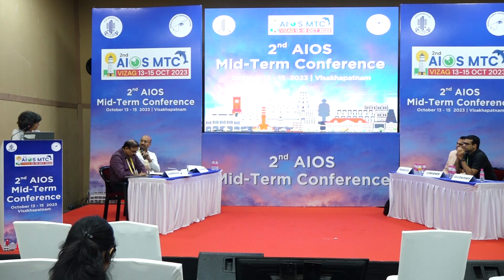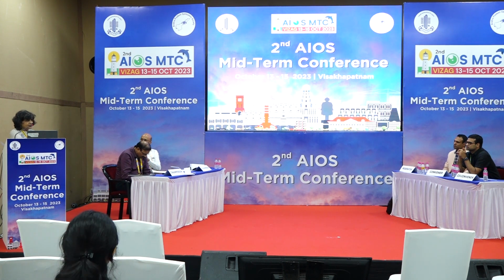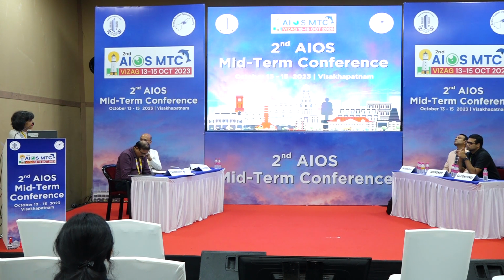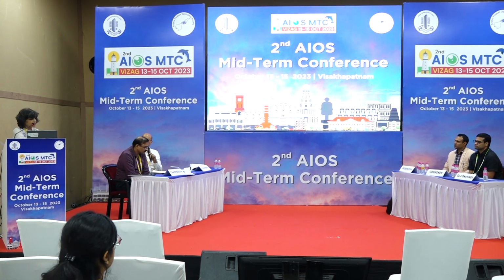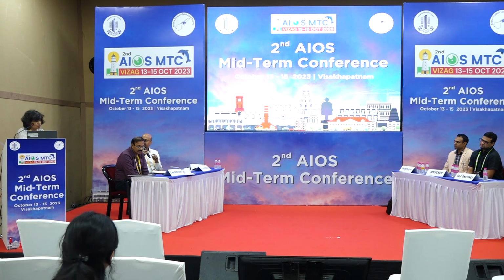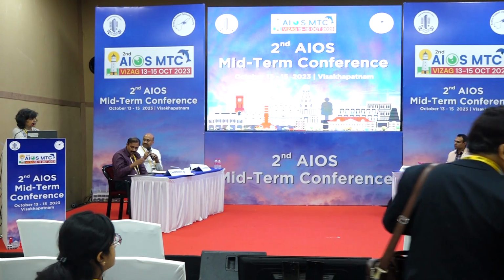Ma'am, how much into the periphery have you tried? I did not have to go much peripheral because most of these were PDRs. Okay. But as peripheral as you can, you can go, and the safety is more. The more peripheral you are, the more the safety, because of the macular toxicity. But I showed one case where we saw subretinal atrophy. So in macular holes we have to be very careful. A hole may close, but vision may not be there.